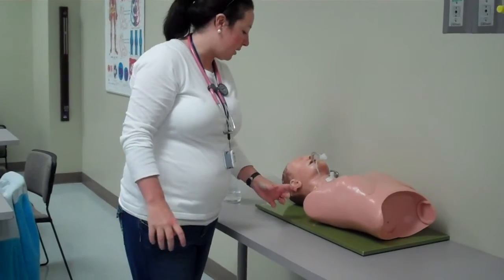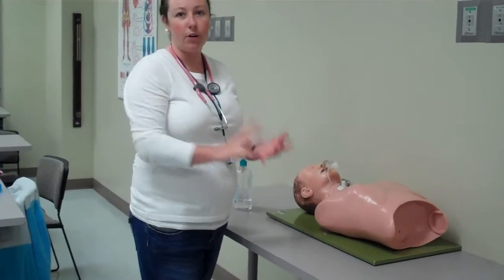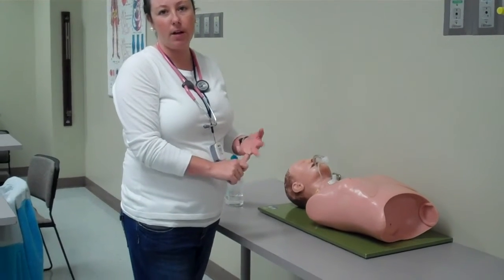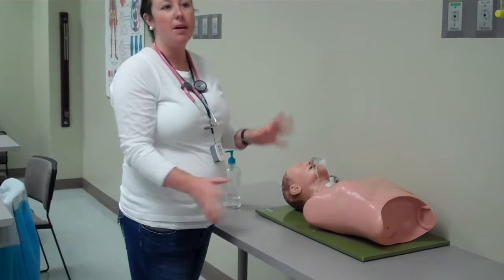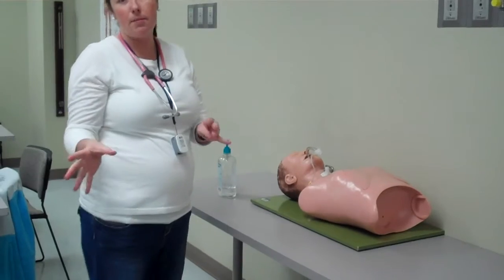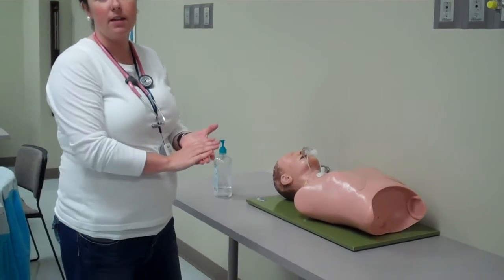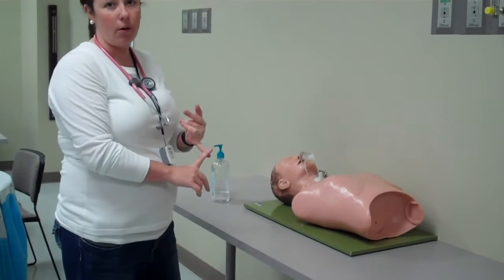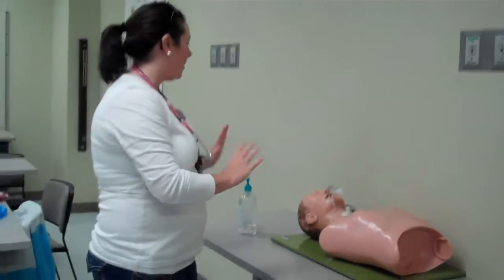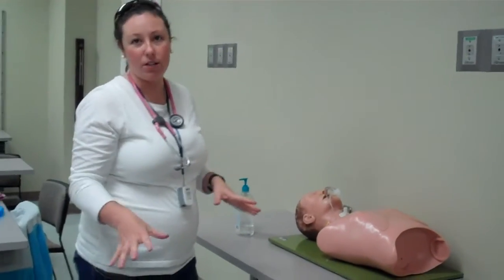I'm going to check his bracelet for his medical record number, date of birth, and name. He looks like the patient that is listed in my doctor's chart — he is the 30-year-old. It's verified, so I know that I have the correct patient.